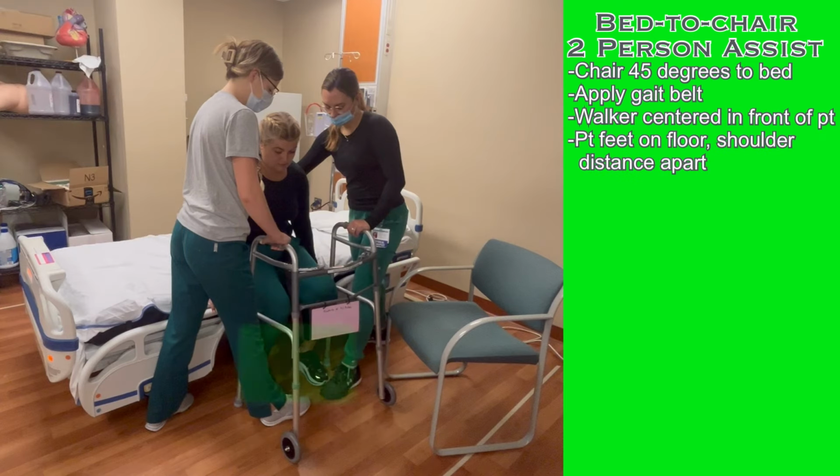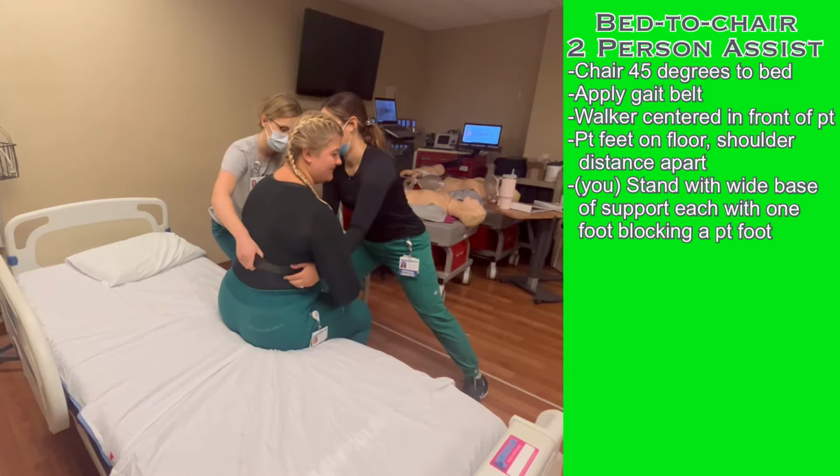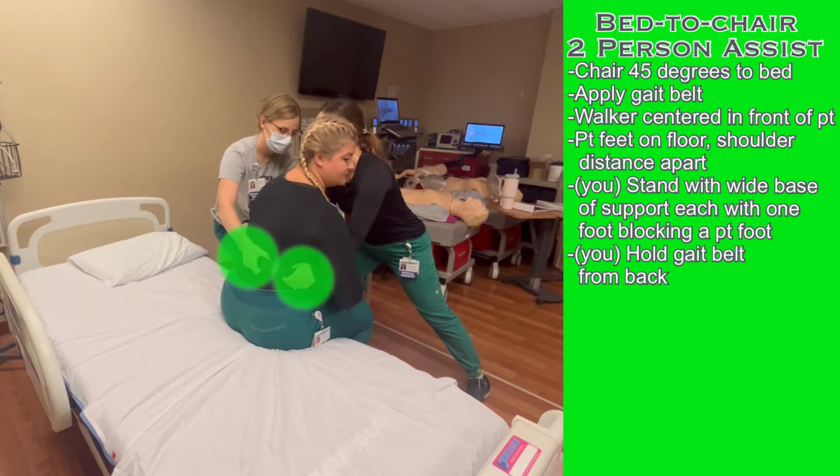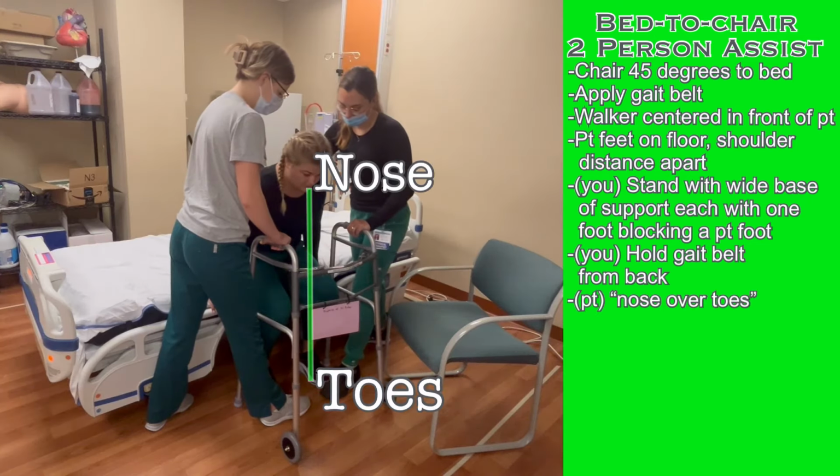Have the patient's feet shoulder distance apart and touching the floor. Have each healthcare worker stand to either side of the patient, with a wide base of support and with one foot in front of and blocking one of the patient's feet from sliding forward. Each of you should hold the gait belt from behind the patient's back. Have the patient lean forward until their nose is over their toes.